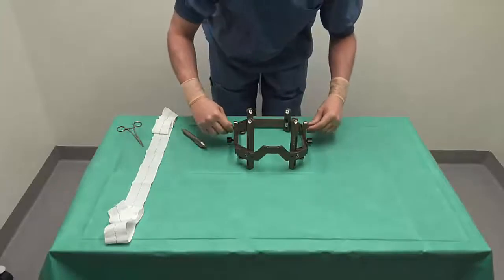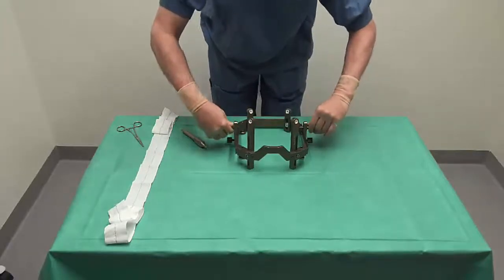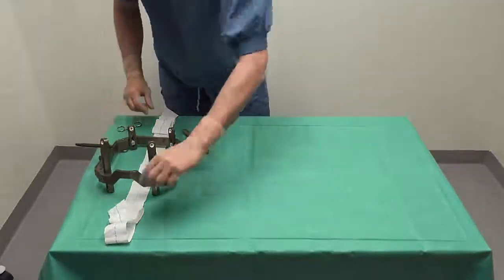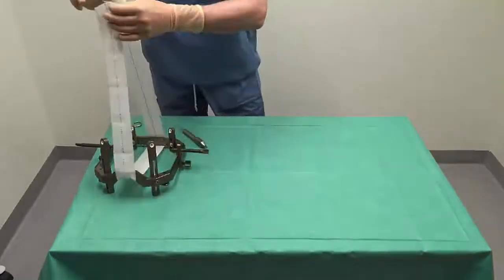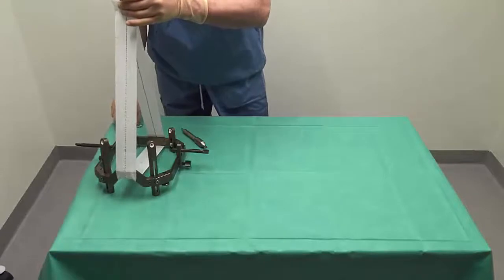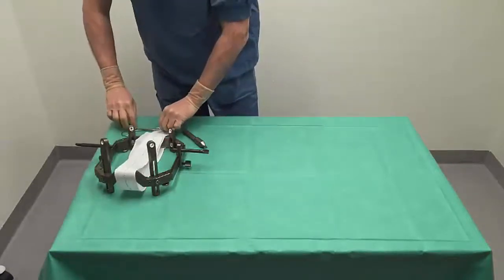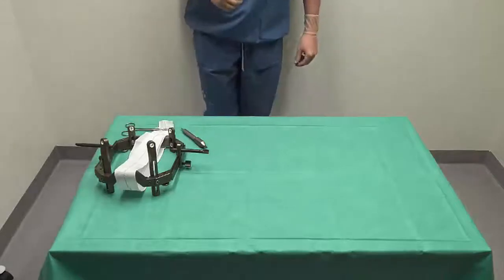We insert the earplugs in the middle hole and rotate them in order to lock them. Finally, we put the piece of cloth around the frame and fasten it with a clamp. And we are done with assembling the frame.